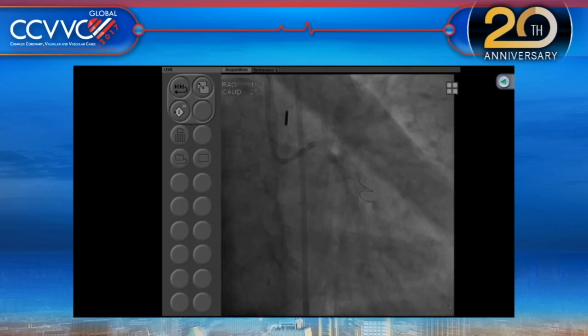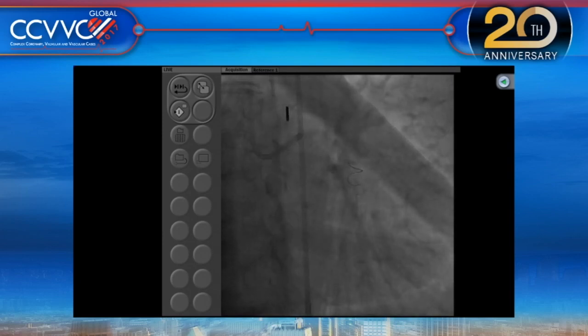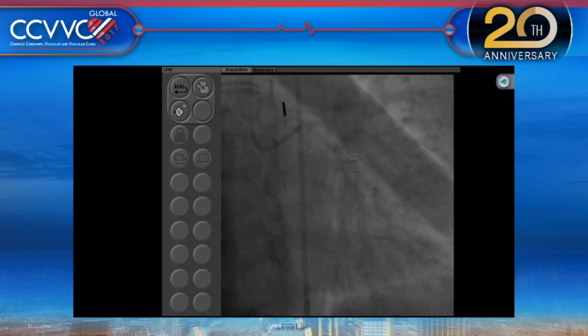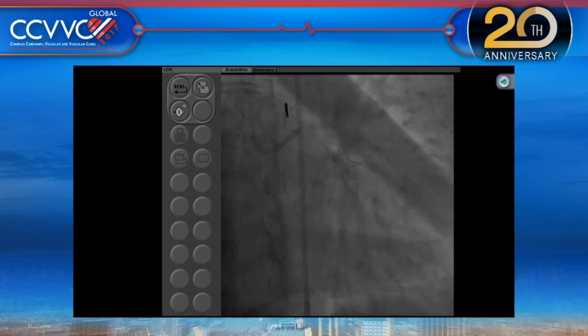This is the case, as you saw. It came from another place actually. They wanted to do surgery, which could be fine. But again, many times these patients are the ones who make the final decision on what to do. And with that note, the patient is here with a 1.5 burr, which we are starting now. Although we don't have much purchase, so I have to be a little slow. Yeah. We put in a balloon pump, although EF is near normal.